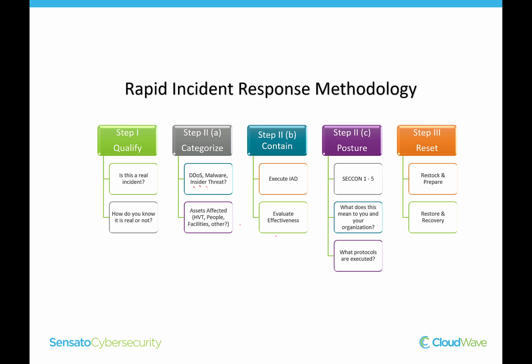Because we're used to responding to incidents that involve data, right? Like, hey, my PC is not acting right, or the server is all of a sudden rebooting every 2 minutes, or hey, we've got some ransomware. Those are all data issues, right? And as soon as we flip that script and we go, wait a minute, the most important thing you can do in IT is protect patient care, right? Your job is to enable and assure that systems never impact patient care. The lack of a system or the use of a system never impacts patient care.